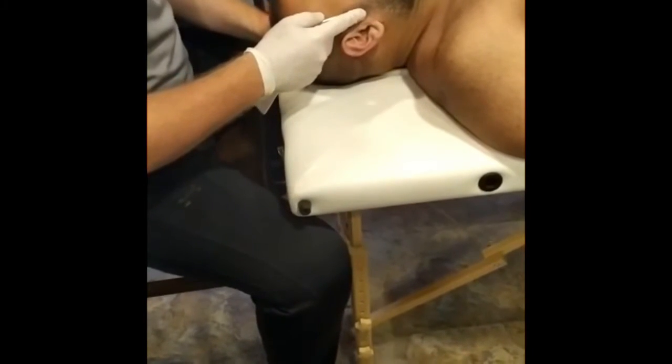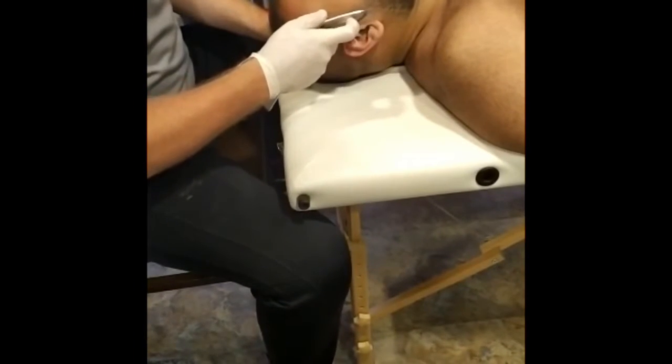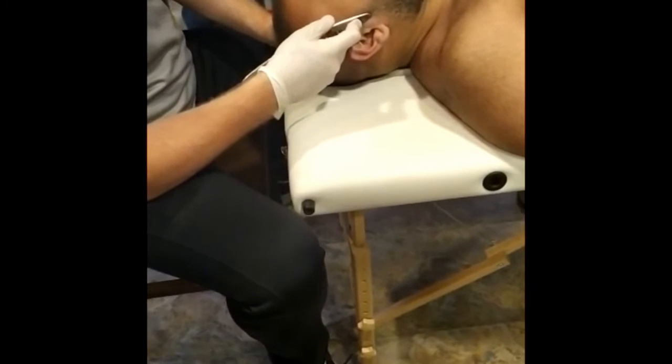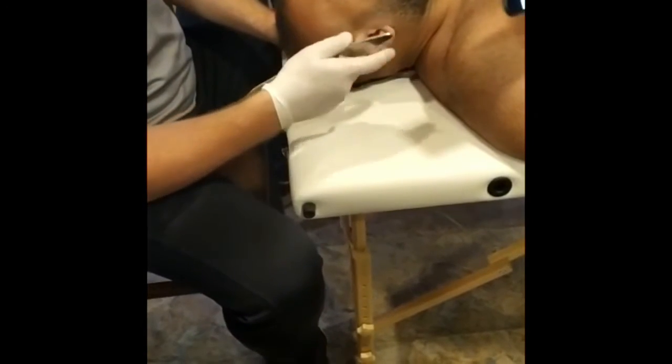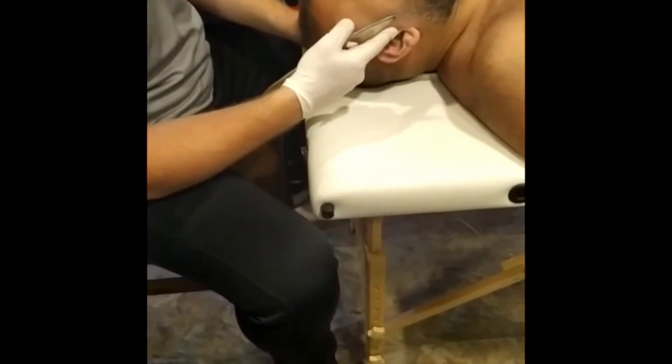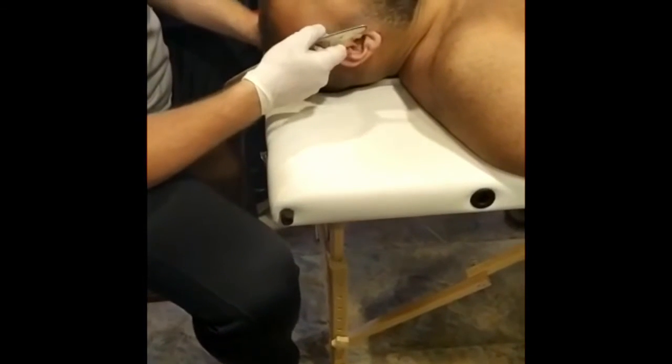He's going to pin it down as he's closing it. If you want to get a little more range of motion, you do what's called the drag — so we're going to push it down here, index finger on. I don't like having, especially in small areas like this, metal right up against the skin.